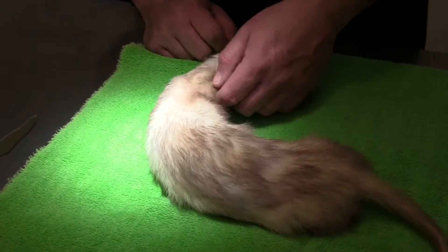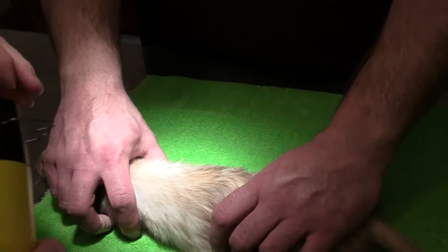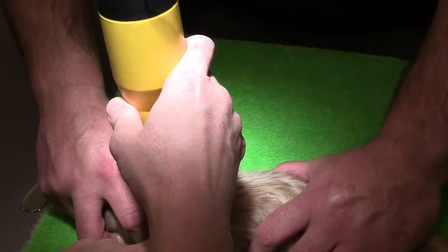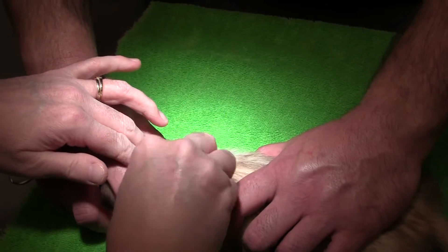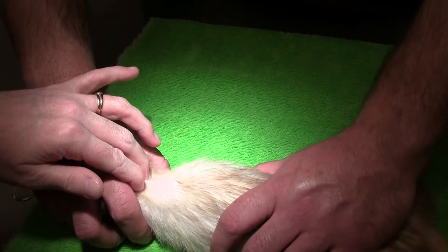It helps to have a good restrainer. So basically I just shave a little spot here. I do basically a little surgical prep, to help keep it from getting infected.